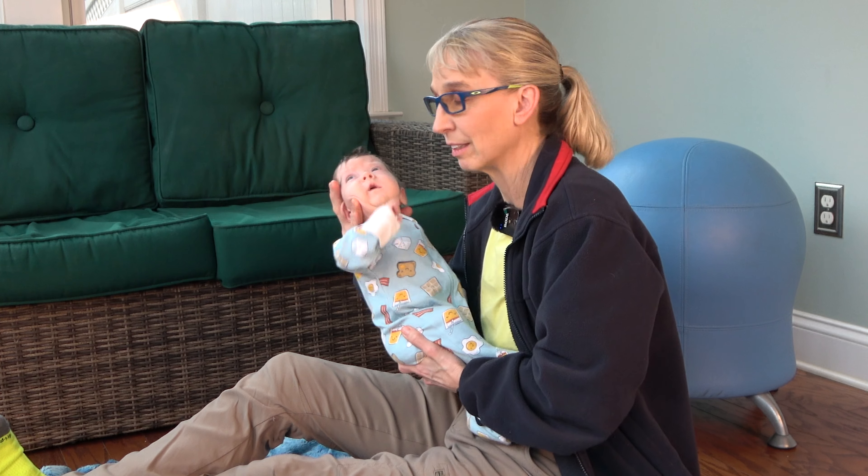You want to put his neck in about the center of where all these lines are, and you want to see how far you can laterally flex his head — to his left, that's about 30. And that's about 40. I think that's 40 degrees to his left. I'm just lining up an imaginary line through his nose — and about 30 degrees to the right.